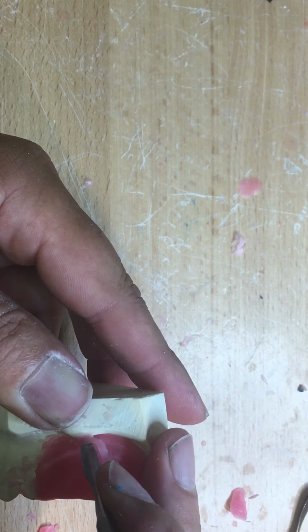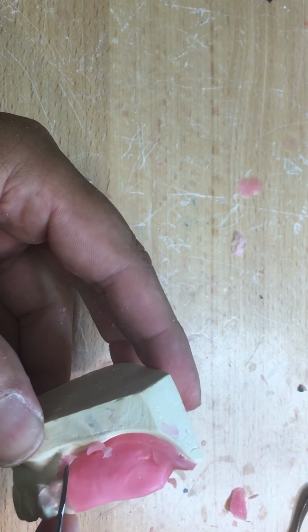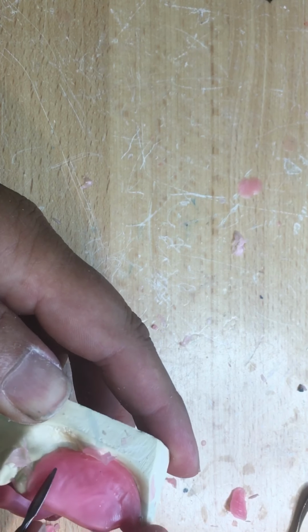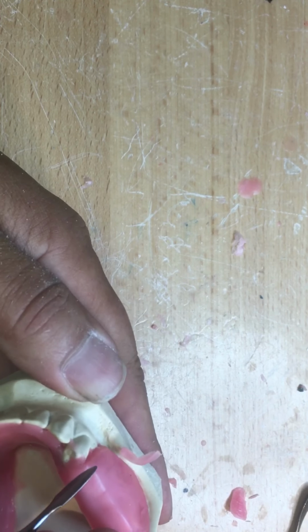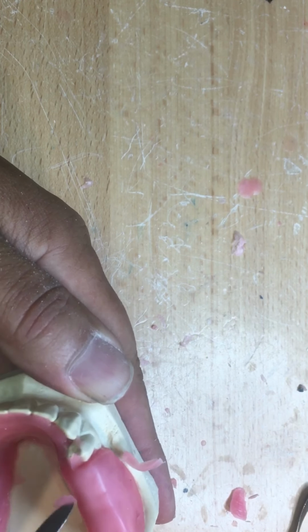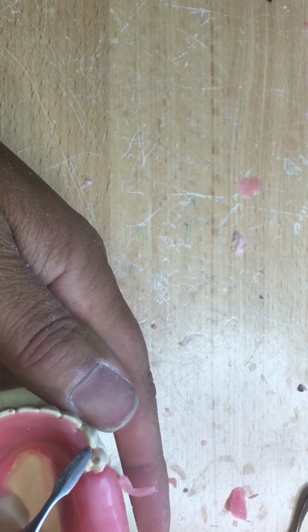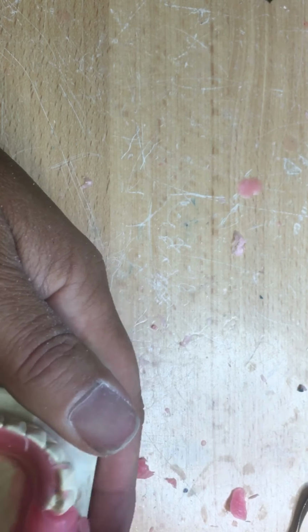I'm going to give it a few more minutes to harden up here. At the same time, I'll shape the extensions. It should be somewhat of a denture. Do not cover the buccal side of the tooth like I did here. It should come straight down the guide plane. No wax on the occlusion as I'm taking it off. No wax above the anterior teeth.